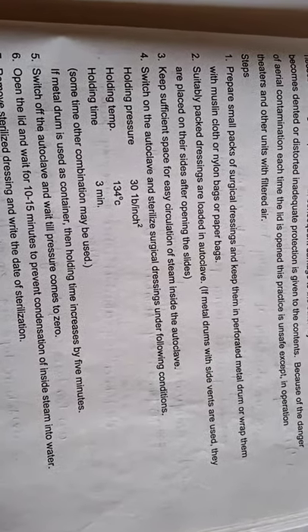For the sterilization procedure, you have to prepare small packs of surgical dressings and keep them in a perforated metal drum, or wrap them with muslin cloth, nylon bags, or paper bags. For packing, muslin cloth, nylon bags, or paper bags can be used. Then the suitably packed surgical dressings are loaded in an autoclave.